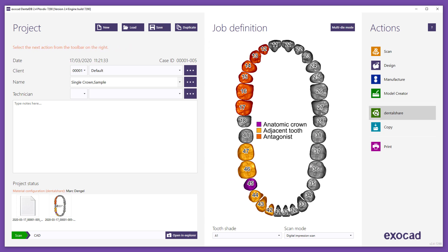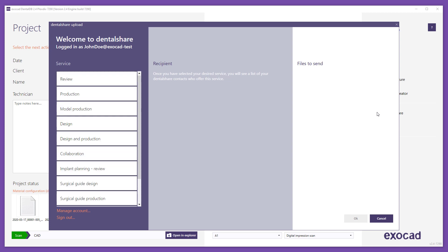Open DentalShare upload window. This window shows a list of services offered by your contacts. By using Review, you can send a review request with scan file to your partner. By using Design, you can send scan data to get the design from your partner.